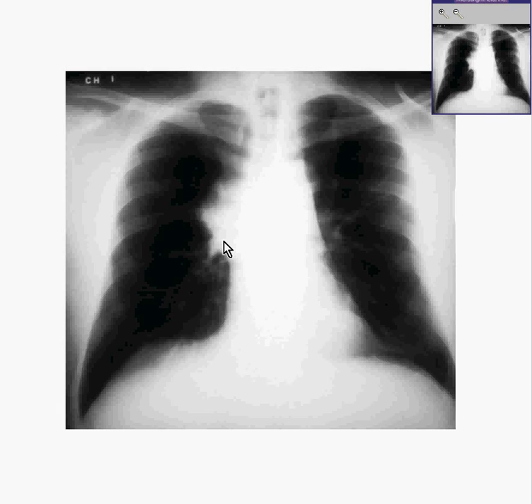You may or may not have remembered that about 23 slides ago, I told you that if your mind wanted to think very, very simplistically, which every mind strives to do, you could think of lymphomas as being of two types, Hodgkin's or non-Hodgkin's. Most of the lymphomas are non-Hodgkin's, but there's a lot of Hodgkin's. Maybe it's a 3-to-1 ratio.